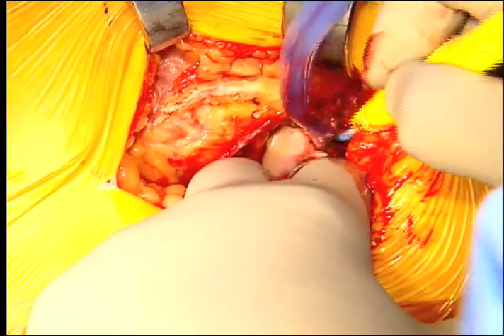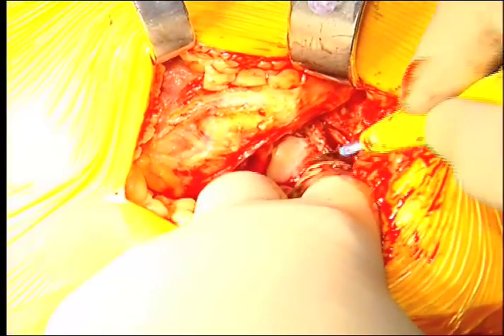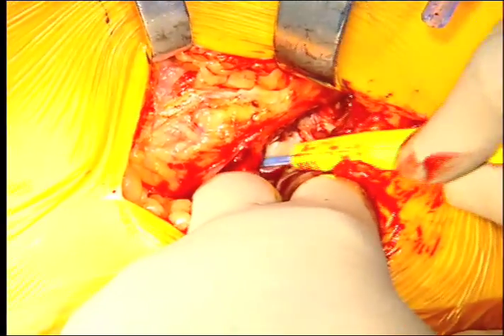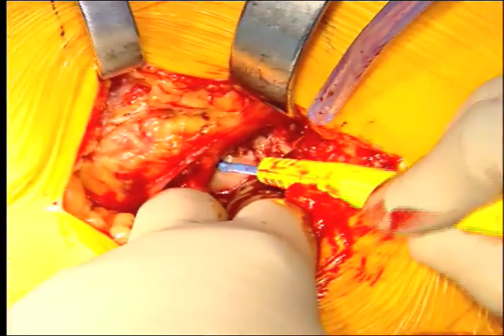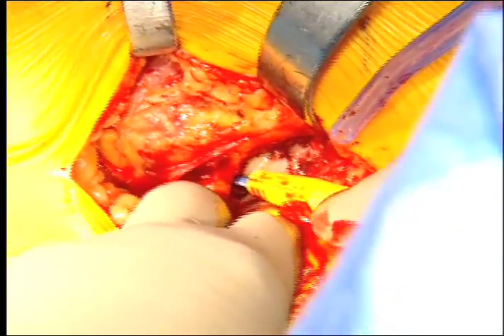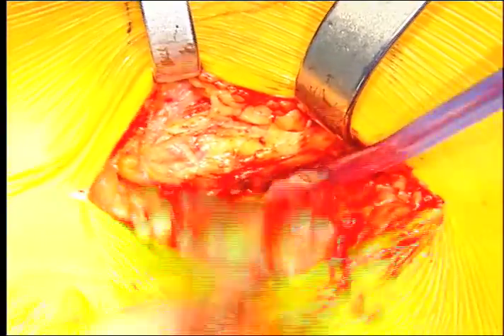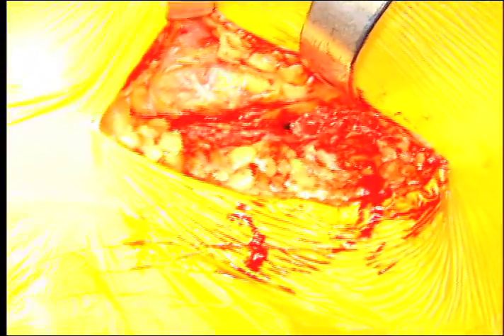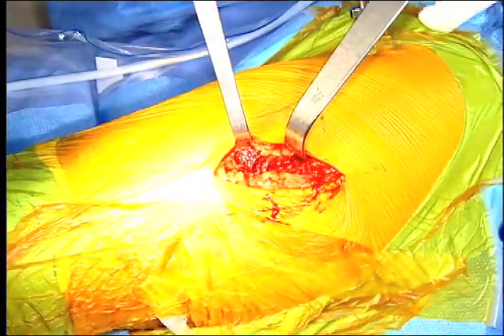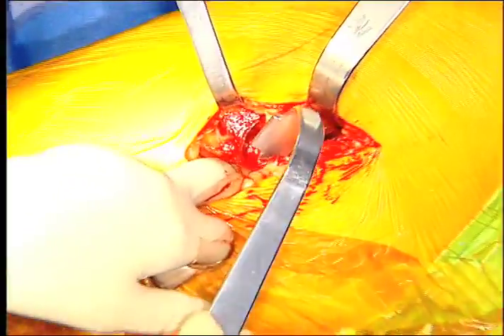I come down to the edge of the acetabulum and go under the quadratus to try not to get the medial circumflex, then open the capsule along the neck. At that point I dislocate it — and we were successful. I was a little worried about the osteophyte, but I didn't have to deal with it.